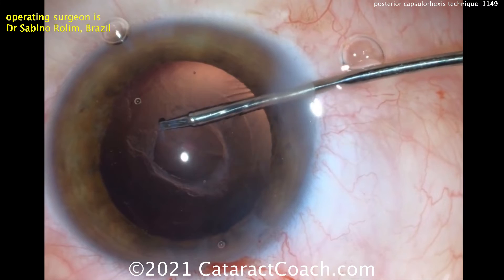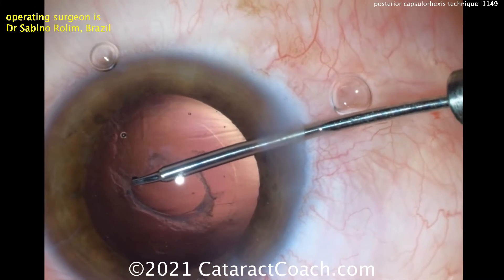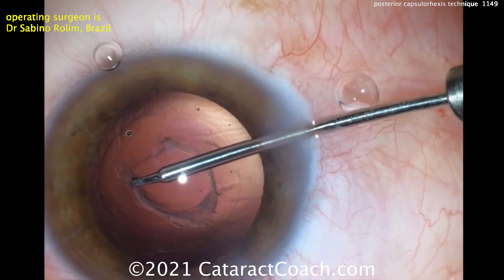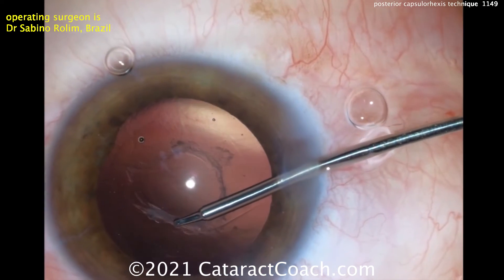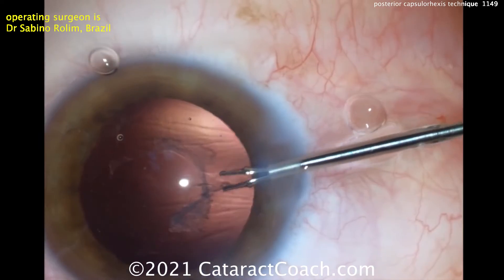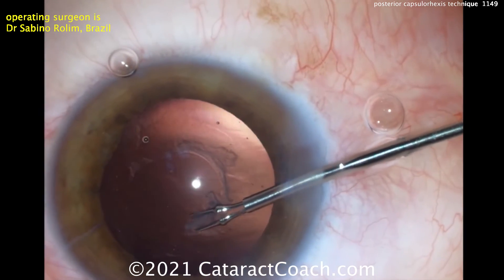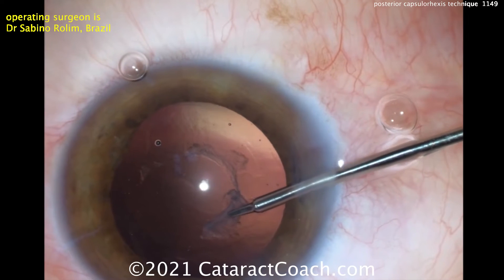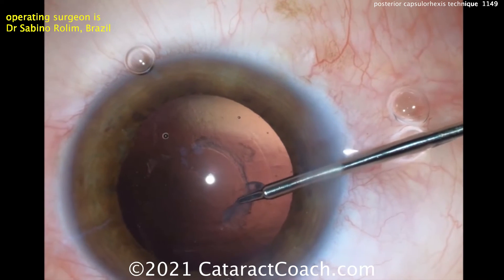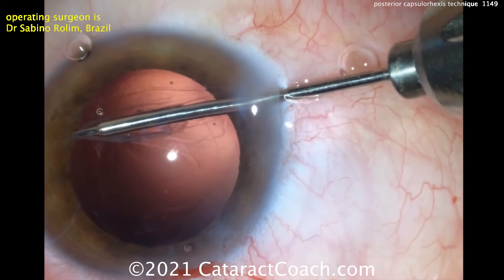If the posterior capsule does open wide, you can still put in a three-piece lens with the haptics in the sulcus and the optic captured behind the anterior capsular rhexis. But in this case, we're going to show you something even neater: putting the IOL still in the capsular bag. Now you can see the persistence has paid off, and he's able to create that round continuous curvilinear capsular rhexis in the posterior capsule using those forceps, fully encompassing that scarred area.